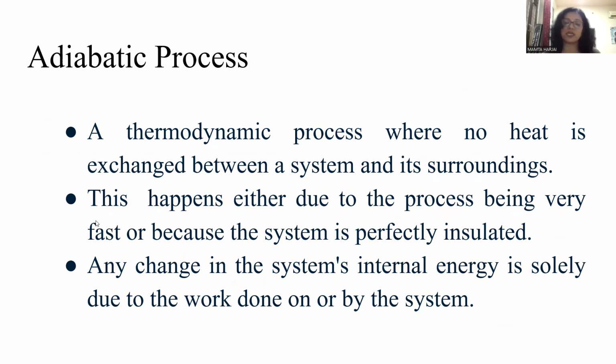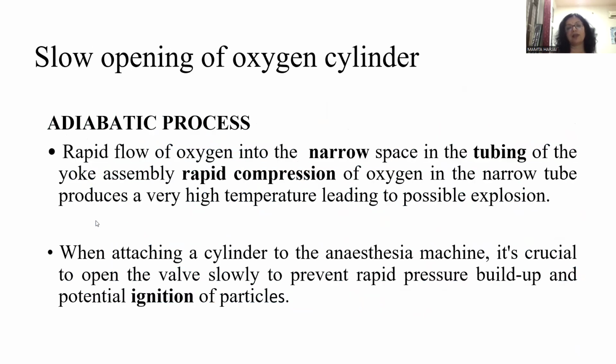What is an adiabatic process? An adiabatic process is basically a thermodynamic process where no heat can be exchanged between a system and its surroundings. So how does this happen? This only happens when the process is very fast or the system is perfectly insulated. So how is the system's internal energy changing then? The system's internal energy changes solely based on the work done on or by the system. It is taking up the heat from the system only.